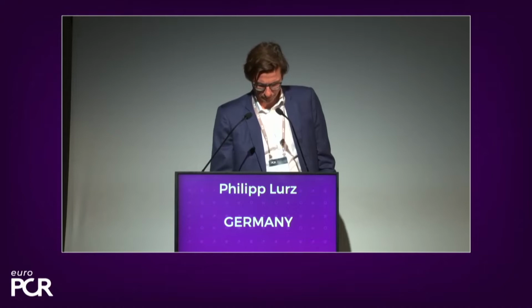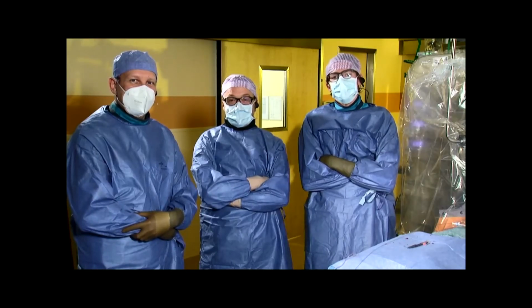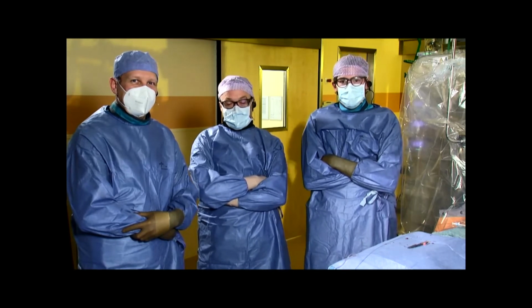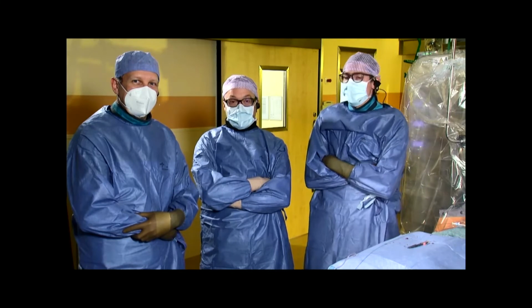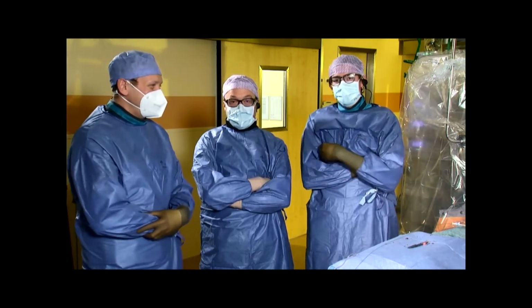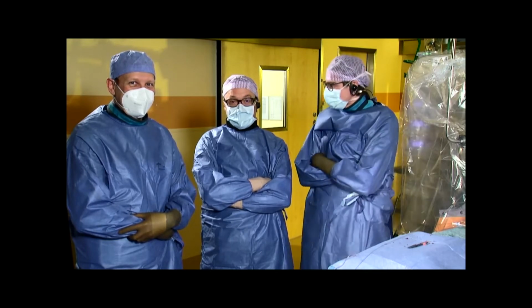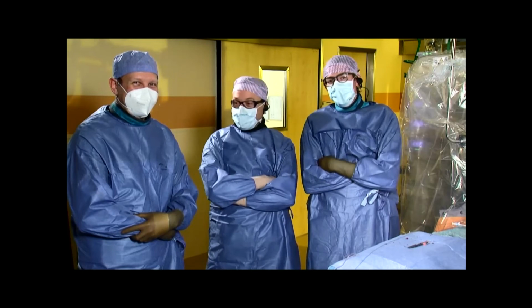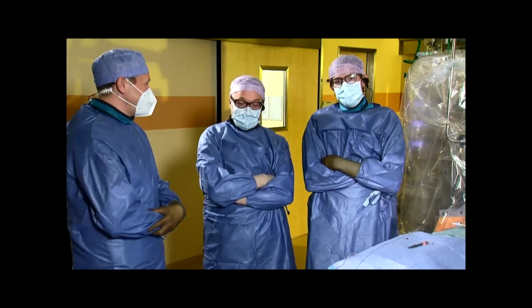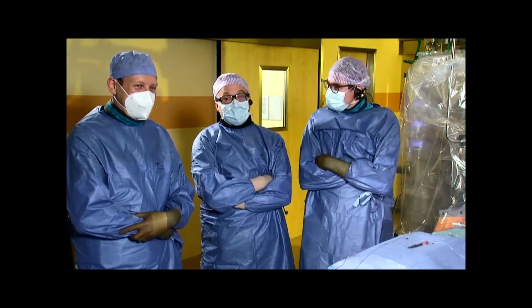Hello and a very warm welcome to Heart Center Leipzig for PASCAL implantation to treat a patient with degenerative mitral regurgitation. I have with me today, as always, my dear friend and surgical colleague Thilo Noack. And then we also have the honor and privilege today to be supported by Jörg Hausleiter from Munich, one of the legends in the field. And I dare to say that what we are faced with today is quite challenging.